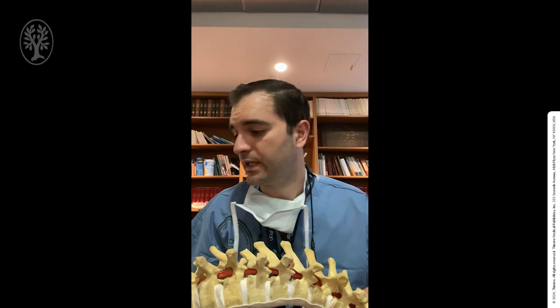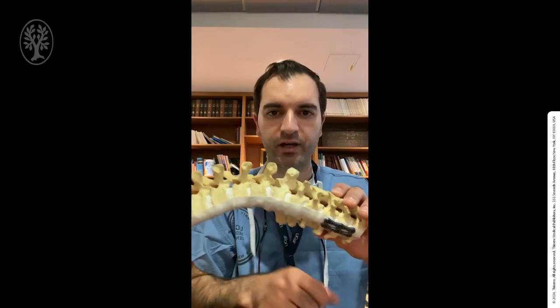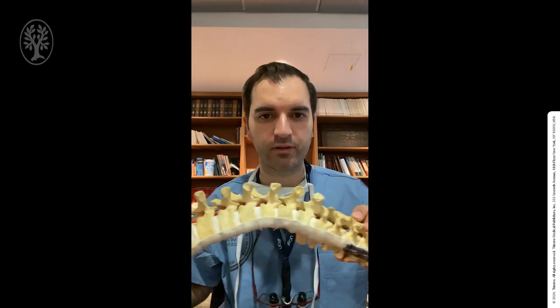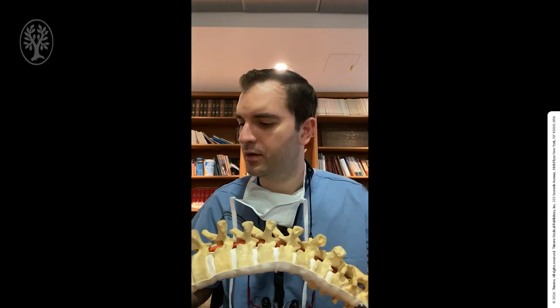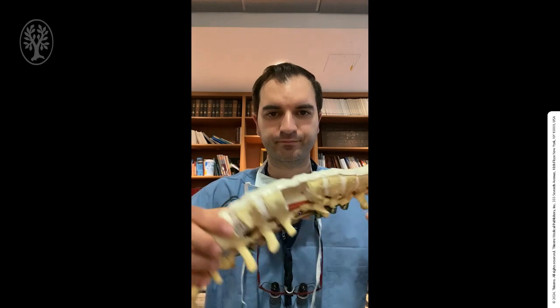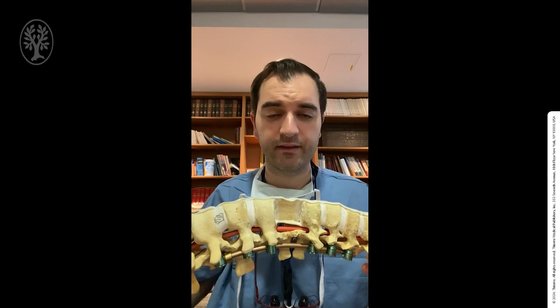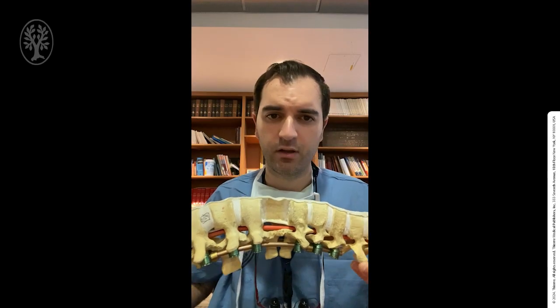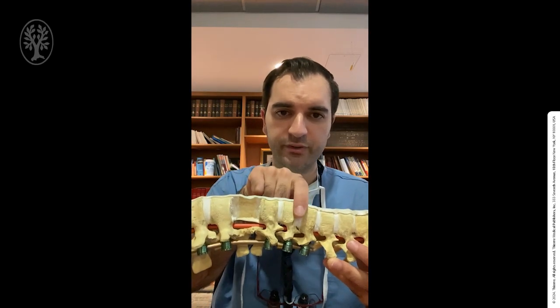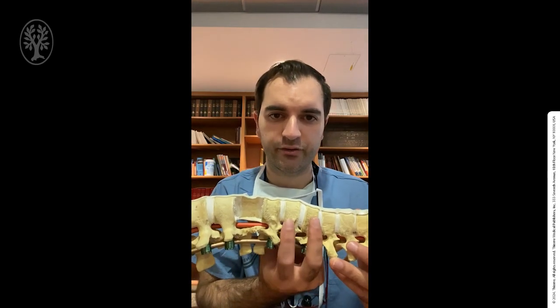There are other longitudinal connectors we can use besides the rods. We can use cords if less rigidity is desired. And we can use plates, as seen here, into the anterior cervical spine, into the anterior lumbar spine, the lateral lumbar spine, etc. Furthermore, if we do a corpectomy, as seen here, we can place a cage in that site, and that can be considered a longitudinal connector. A smaller cage can be placed if you do a discectomy, and that can be considered a longitudinal connector, connecting two anchors in each vertebrae.